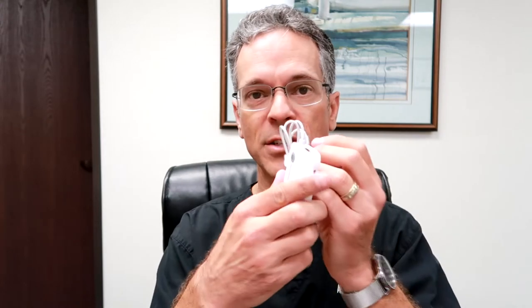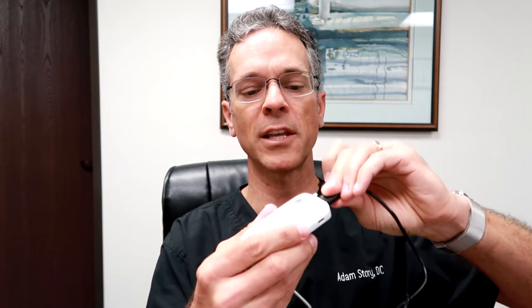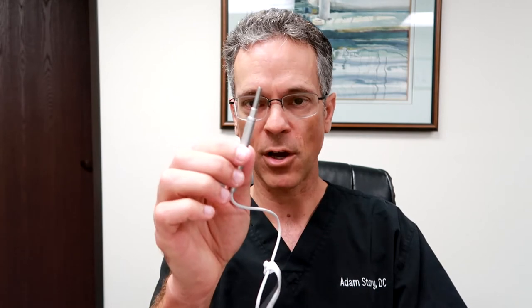How this works is this device hooks into your phone. This is a company called Teslong, and what you're going to do is plug this in to the device and then plug it into your cell phone. The cell phone is used as the way to get the photo or actually the video. It comes with a lot of different things, including different sizes of tips that you place on here.